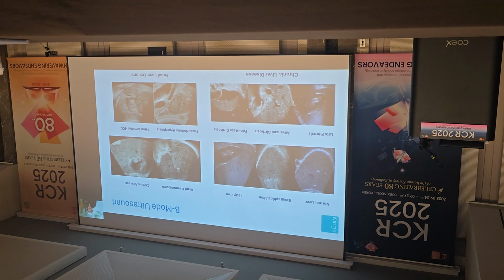The focal liver lesions that we see include hemangiomas most commonly, but these are tending to become more and more atypical. You may see focal nodular hyperplasia or HCC from the B-mode imaging, but these will require further assessment, very often with CT or MR. But now contrast-enhanced ultrasound should help you to get to the final diagnosis and interpretation very rapidly.